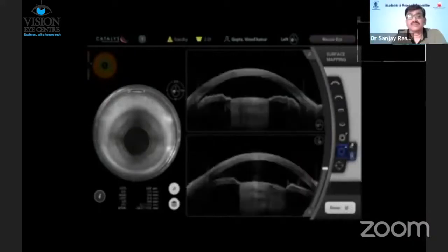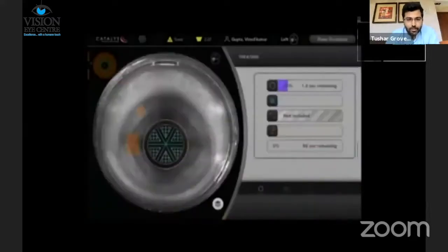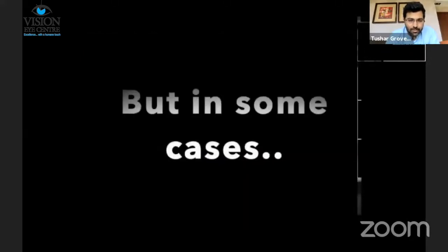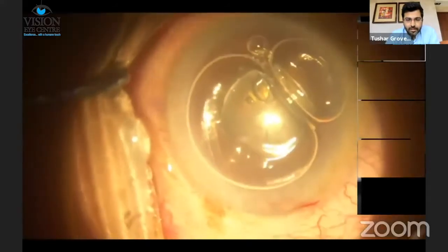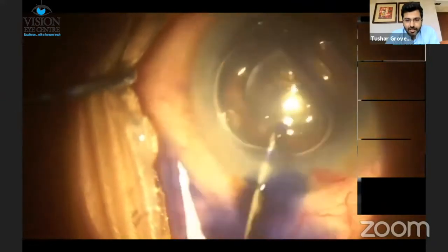That usually works well, and we usually get an adequate-size rhexis which is well within the pupil diameter on most instances. But sometimes this can go wrong, such as in this case where once we took the patient up for surgery, we noticed there was some pigment dispersion, which is why we stained this particular patient.